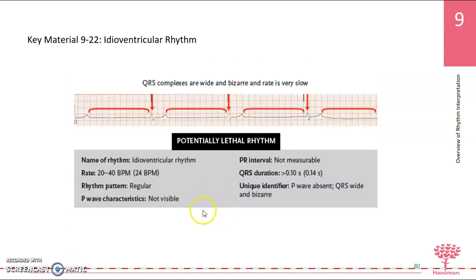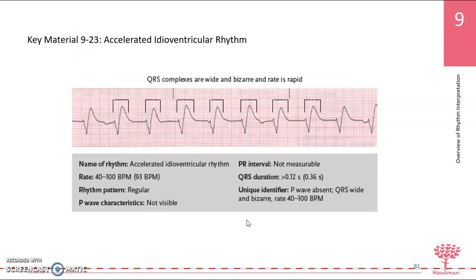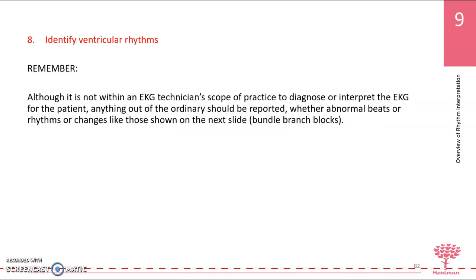Ventricular escape beats. Again, these are ones that you need to go back and look through yourself and make sure that you're understanding and being able to recognize them. That program that I gave you online is really good for you to do that too, to go through and remind yourself what they look like. The flashcards are helpful. Going through these in the slideshow format so you can see what you should be looking for.